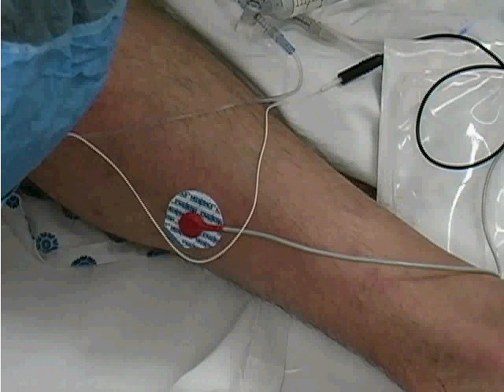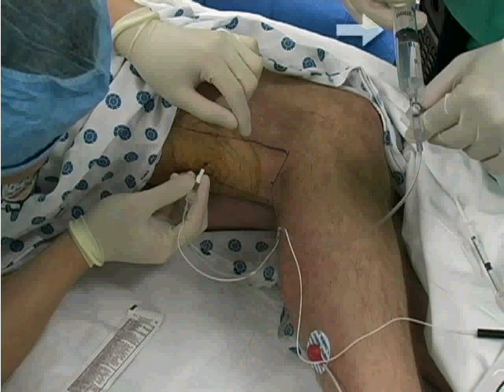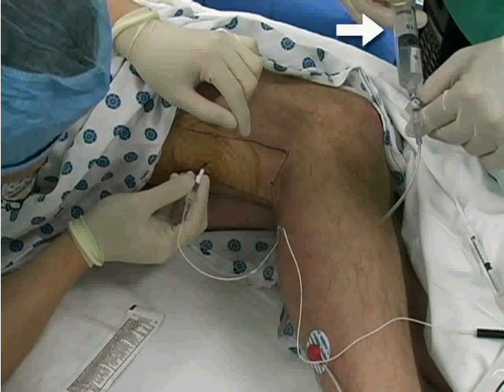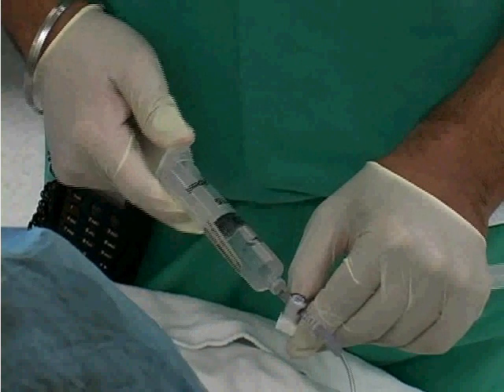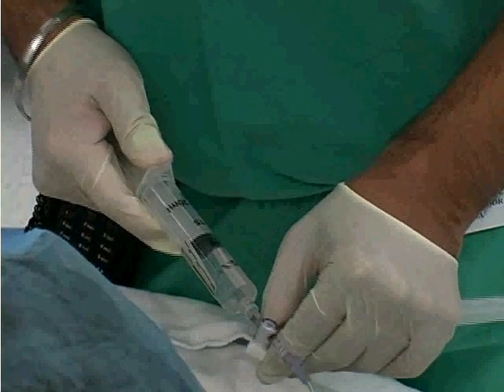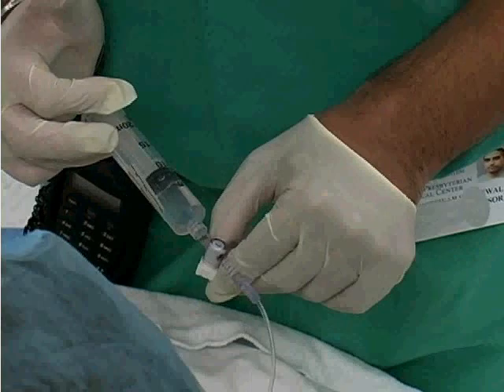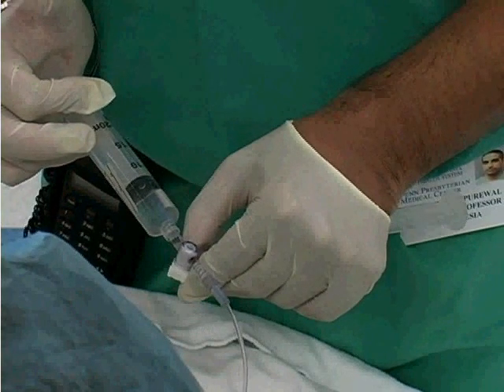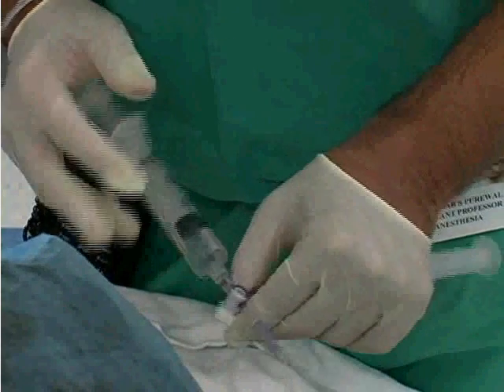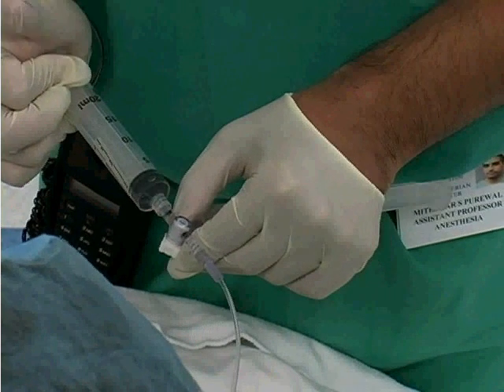When muscle twitch is sustained at 0.5 milliamps, it is appropriate to inject anesthetic. Aspirate the syringe to ensure the needle tip is not located within a vascular structure. Inject the anesthetic in divided doses, monitoring the patient for signs of intravascular injection. Warn the patient of signs or symptoms they would experience if the anesthetic were injected into a vessel. Aspirate the syringe after each 5-milliliter dose. Inject a total dose of 40 milliliters of anesthetic.